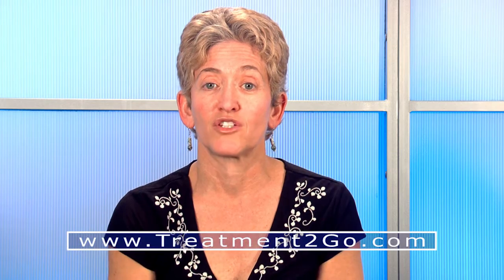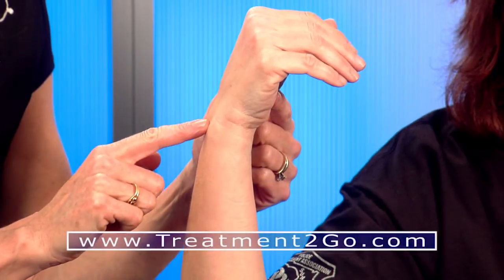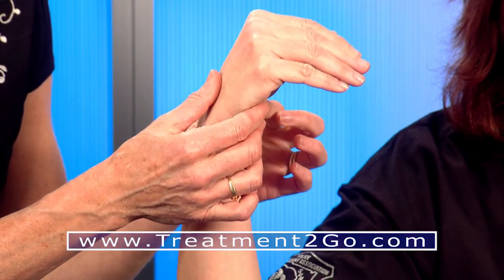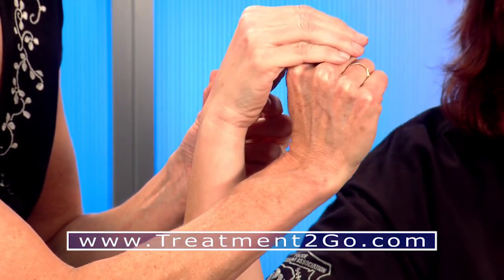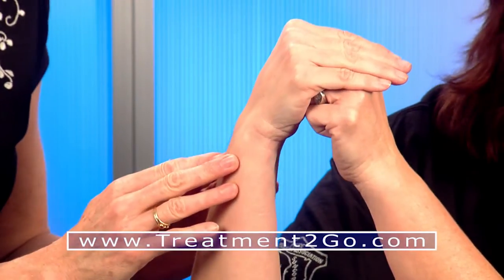I'm going to demonstrate that splint for you right now. In positioning my patient, I want to maintain wrist flexion of 20 to 30 degrees and MCP flexion of about 70 to 90 degrees. In order to maintain this position, I'm going to have my patient make a fist with her opposite hand and hold it underneath the IP joints to keep them straight, so I don't have to worry about the position.